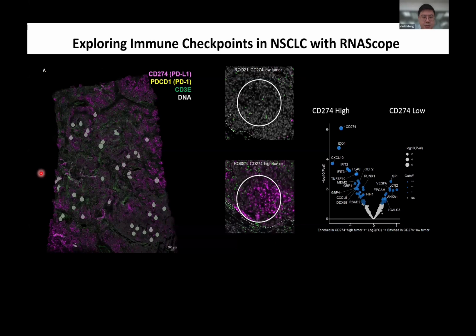Here I have another example. What they have here, they actually stain the cells with RNAscope. So other than antibody reagents for imaging, Nanostring also has an option for users to use RNAscope, which is an RNA probe-based imaging reagent to stain for IHC image. So here, this is the staining on the tissue.